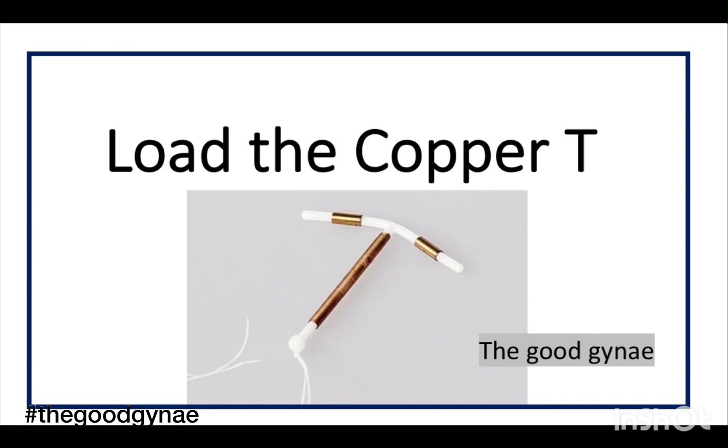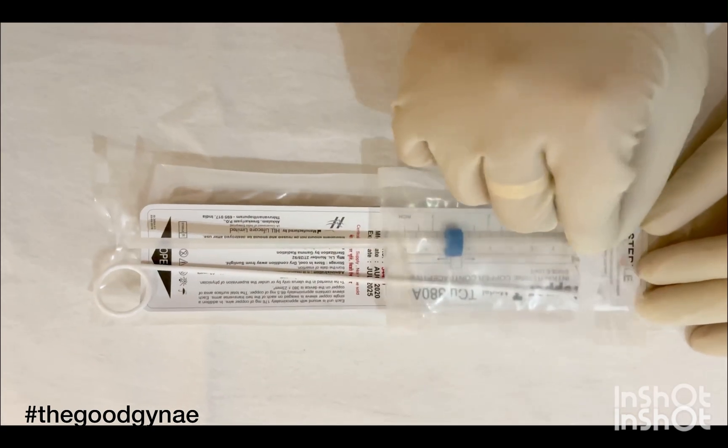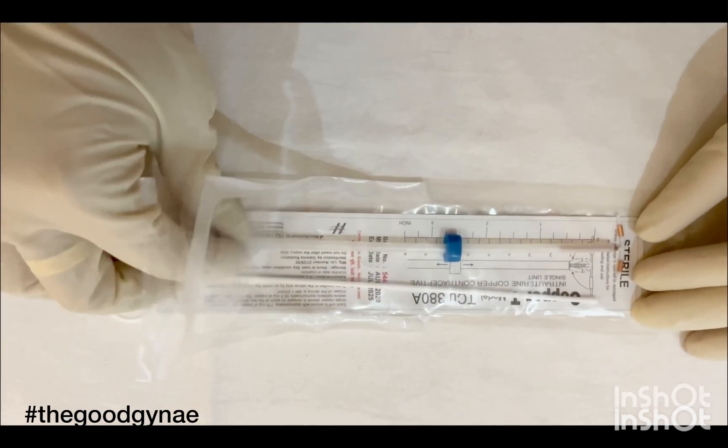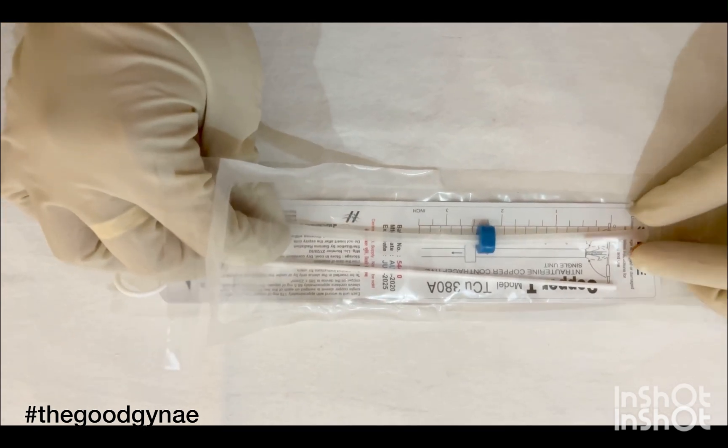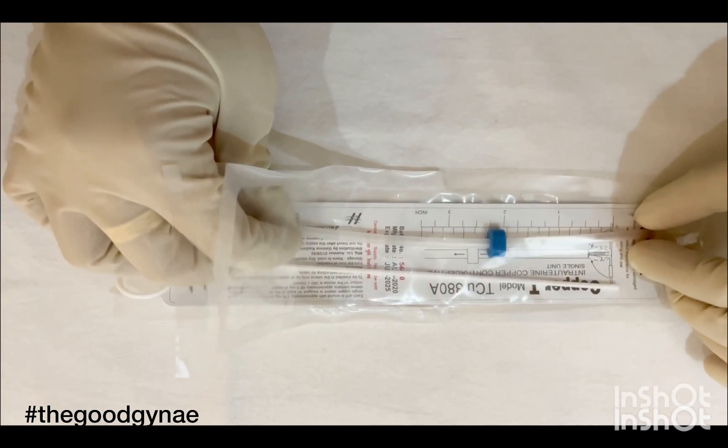Now we load the copper T, or ask our assistant to load the copper T for us. We open the copper T packet halfway, and while stabilizing the arms of the copper T with the left hand, we push the insertion tube so that the arms of the copper T will approximate.